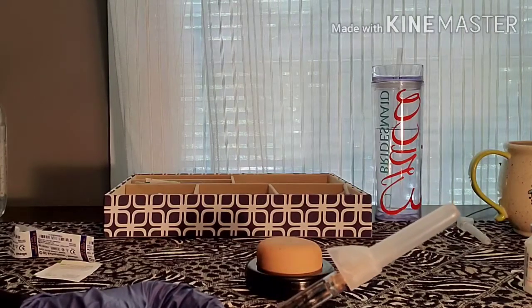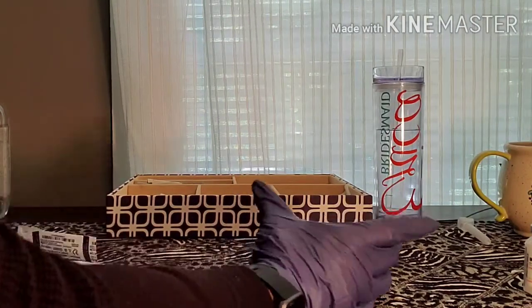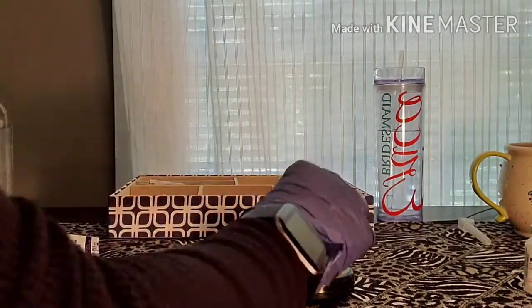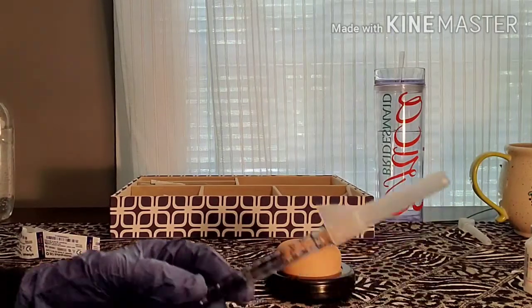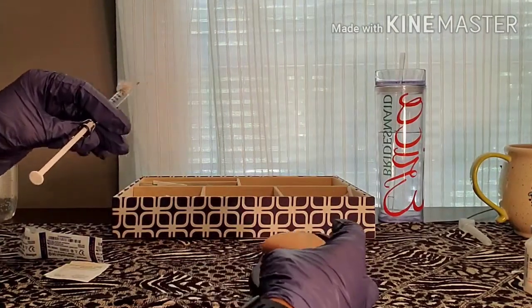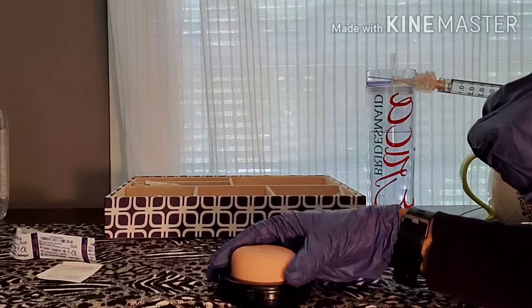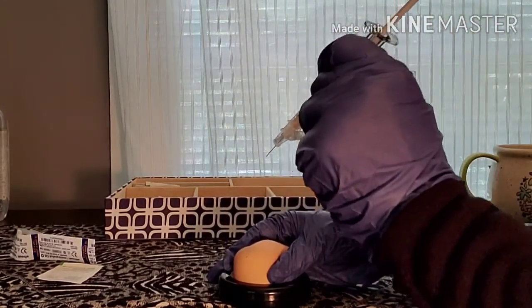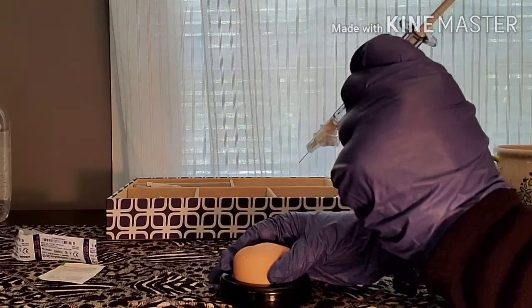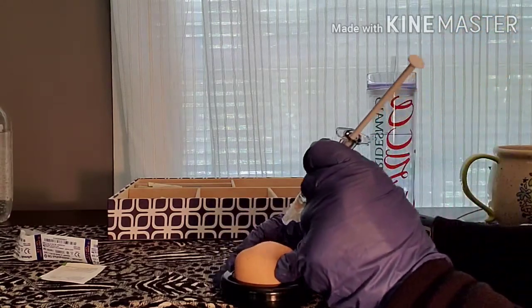You'll decide whether to pinch the subcutaneous tissue based on how much adipose tissue is present — you may need to lift it away from the underlying tissue. In most cases you are going to be pinching the skin. It does say in the book that holding it taut is less painful, but in most cases you'll pinch. I'm going to pinch the skin. With sub-q — same as IM — except you go in at a 45 to 90 degree angle depending on how much adipose tissue you have and the length of your needle.